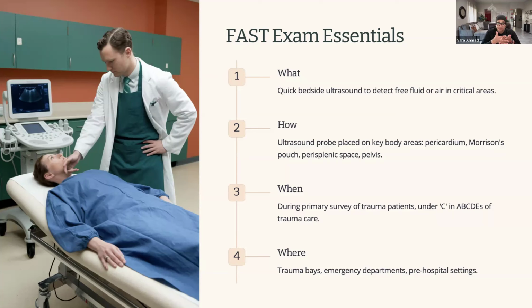For instance, if a patient involved in a motor vehicle collision presents with hypotension, tachycardia, and a distended abdomen, the exam can help identify hemoperitoneum and guide the next steps, whether that's laparotomy or stabilizing the patient before further imaging.